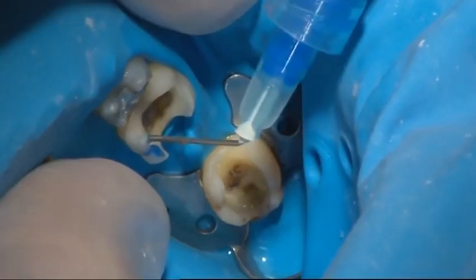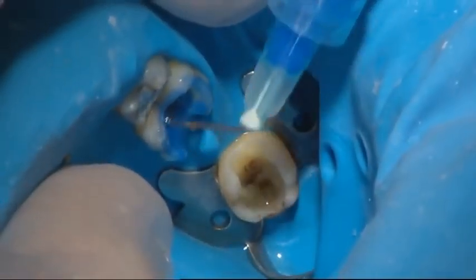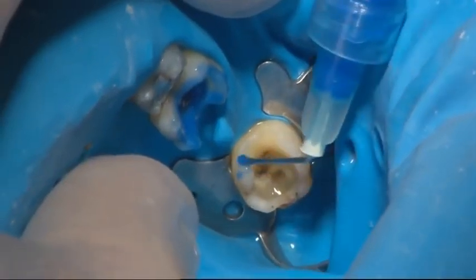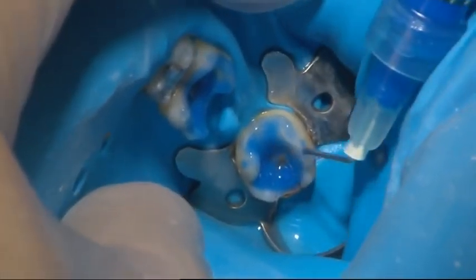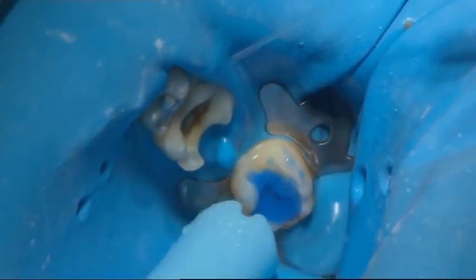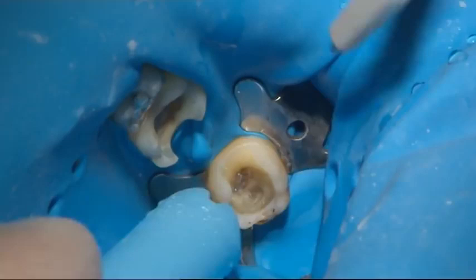The surfaces of the teeth were etched with orthophosphoric acid, according to the bonding agent manufacturer's instructions. The teeth surfaces were rinsed with water and air dried carefully after etching.